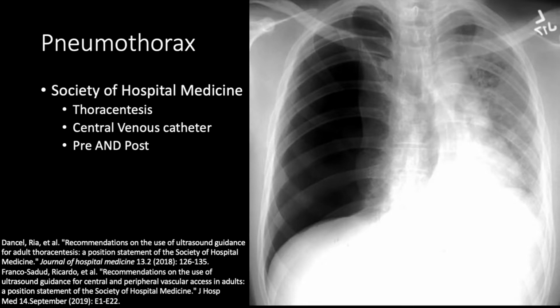And if you know that before the procedure, you'll be more reassured when you ultrasound them after the procedure that you haven't caused this loss of lung sliding. So really, scan before and after with the linear probe for thoracentesis and central lines to monitor for pneumothorax.